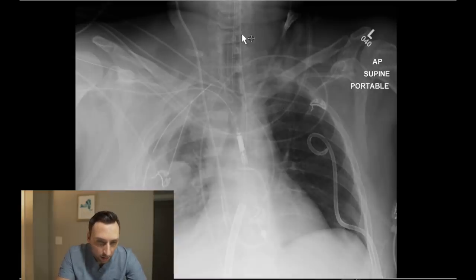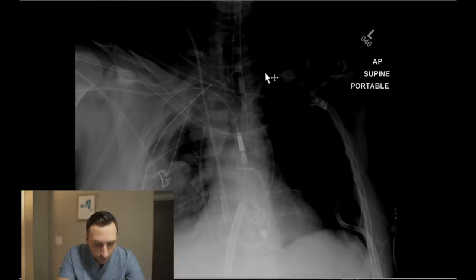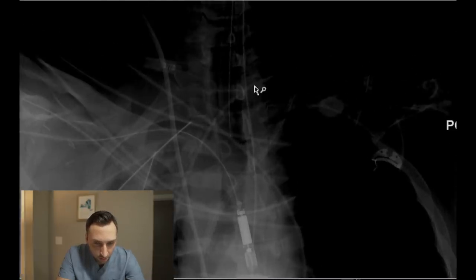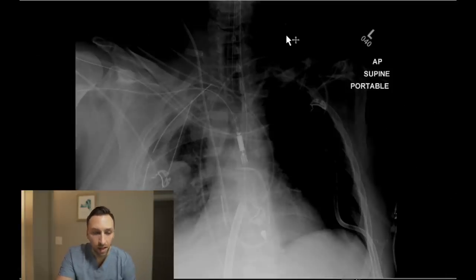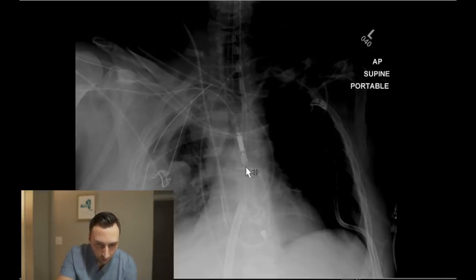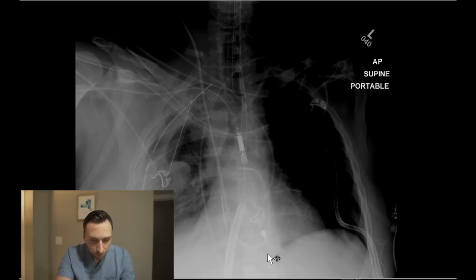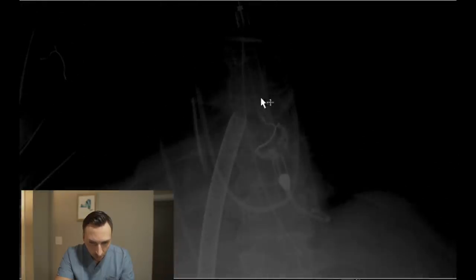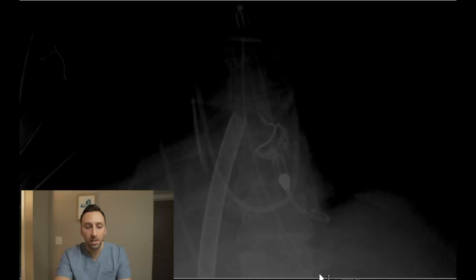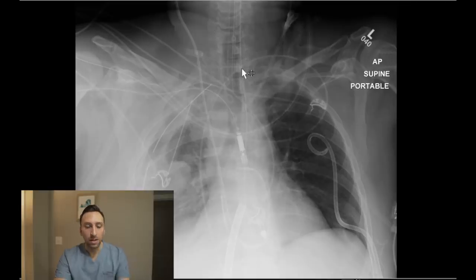Next I look at the airway and esophagus. Right here we have an endotracheal tube — let me zoom in — it's terminating just above the clavicular heads. Next you can sort of see a nasogastric tube coming down. You can follow it coursing down the esophagus through the GE junction, though you can't really see it distally, so you won't be able to comment on its location within the stomach.